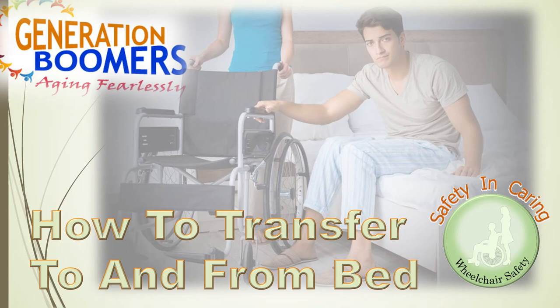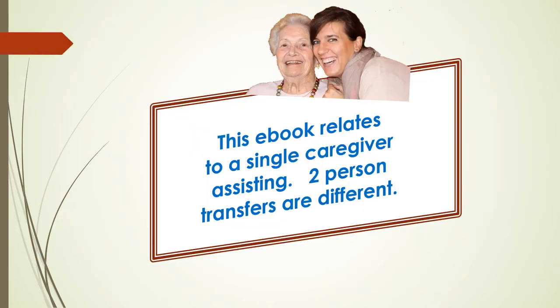G'day, I'm Ron Simonson from Generation Boomers Aging Fearlessly, here today to talk about wheelchair transfers from bed to wheelchair and from wheelchair to bed. You are the sole caregiver in the situation and you have to move your aged senior all on your own. Moving someone to and from a wheelchair, especially when they have a limited ability to help, looks daunting. But once you know how to do it safely, it's much less scary.